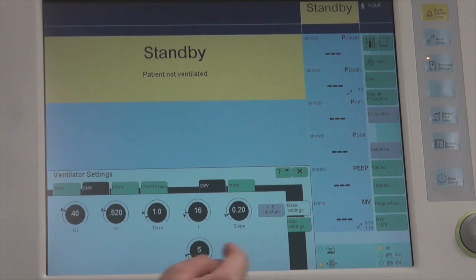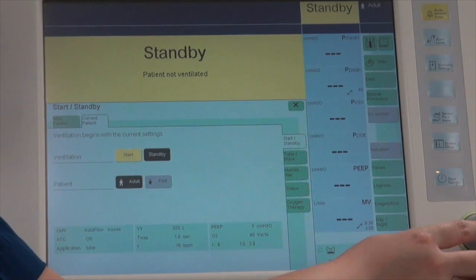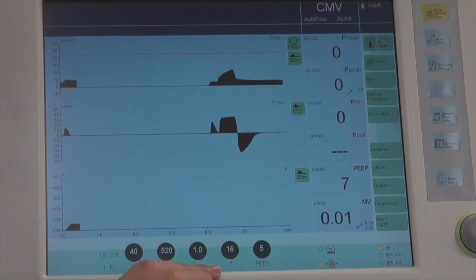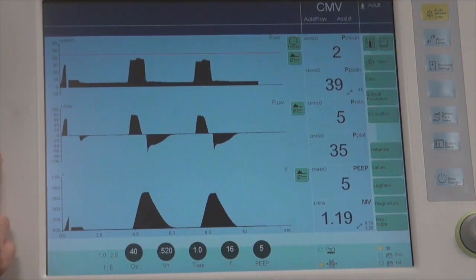Once satisfied with the CMV settings, go to Start and click Start. From standby, the ventilator will transition into the ventilation page. Ventilator settings are displayed at the bottom as previously set, the mode is displayed at the top, and the circuit type selected — in this case an adult circuit — is also shown.